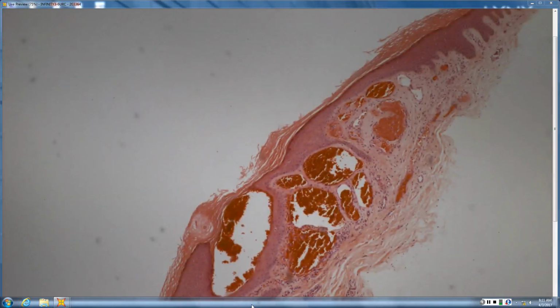Angiokeratoma. So in angiokeratoma, those dilated vascular spaces are pressed right up into the dermal papillae, and there's overlying hyperkeratosis. So it's an angiokeratoma because of the overlying hyperkeratosis. And I have these on my fingers after chilblains. Mibelli. That's Mibelli type, and you can remember it. Just picture a little kid pointing, saying, "This is Mibelli." Right here is Mibelli. So he's pointing with his finger where he had chilblains. So that's the Mibelli type.